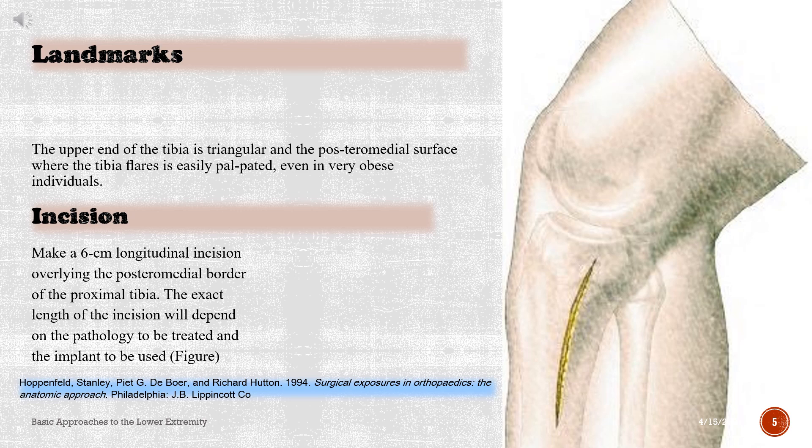Landmarks: The upper end of the tibia is triangular and the postero-medial surface where the tibia flares is easily palpated, even in very obese individuals. Incision: Make a 6 cm longitudinal incision overlying the postero-medial border of the proximal tibia. The exact length of the incision will depend on the pathology to be treated and the implant to be used.